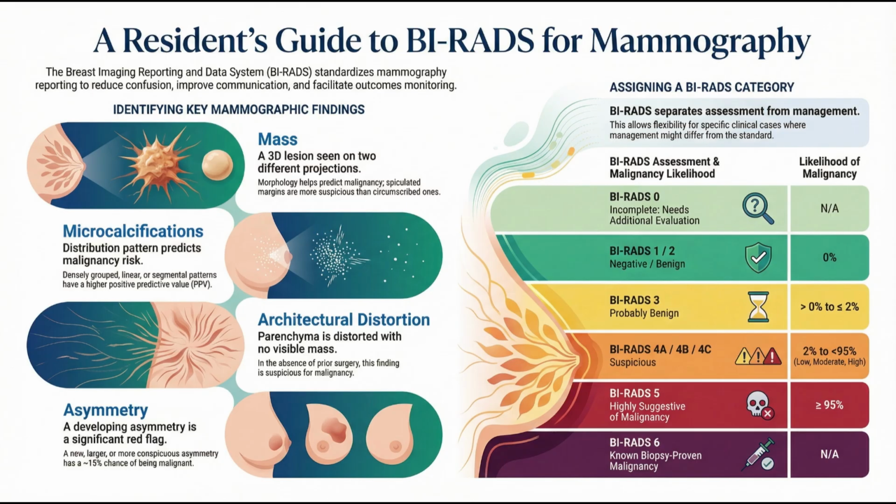Okay, so we've covered the typically safe ones. Let's pivot to the morphologies that demand immediate attention. This is where the predictive value really jumps. It does. The 2 highly suspicious types are all about their microscopic look. First, you have fine pleomorphic calcifications. These are irregular, discrete little shapes, and they're tiny, usually less than half a millimeter.